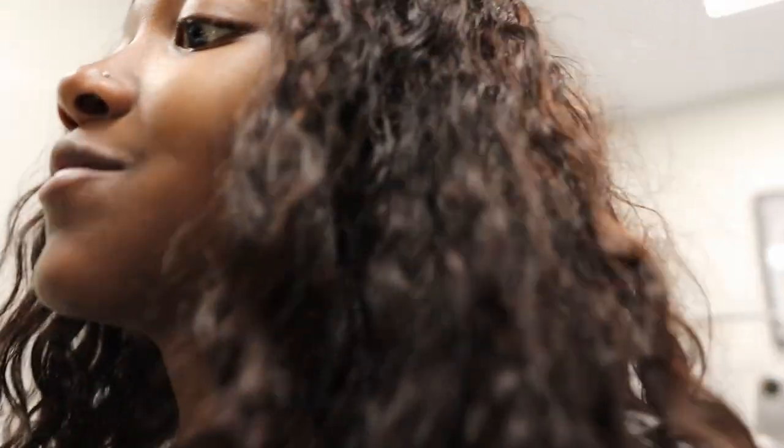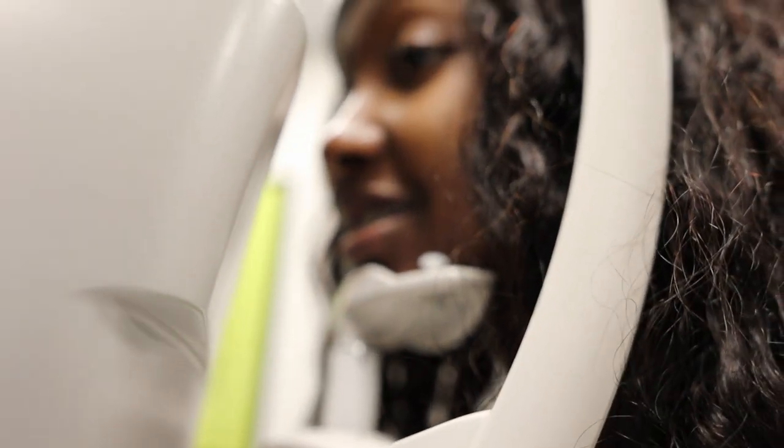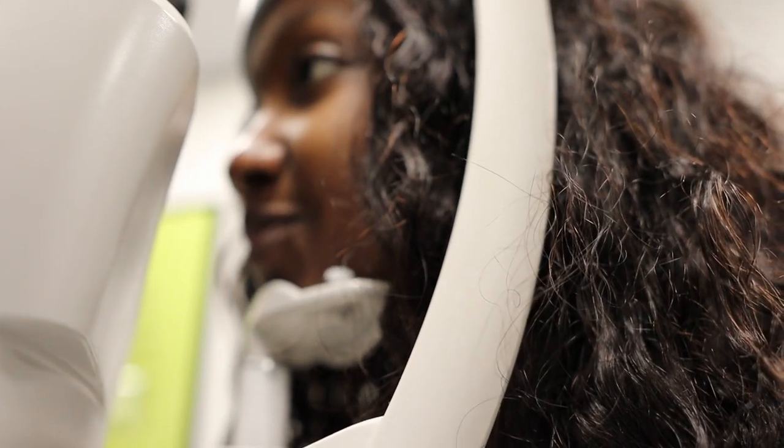Alrighty, we are checking if my eyes are fully dilated. To get your cycloplegic refraction. Okay, so I apparently won't be able to see, guys, for the next 10 hours, which is crazy. Keep looking straight ahead. Sure.